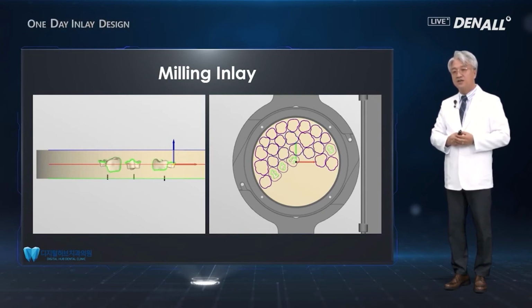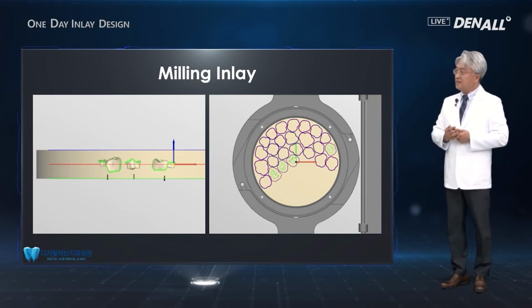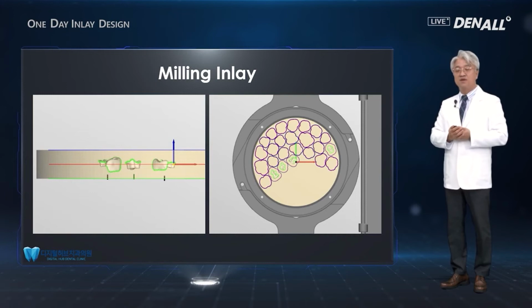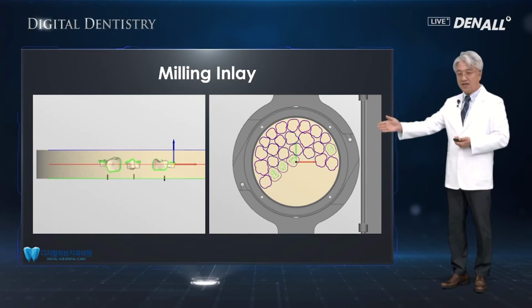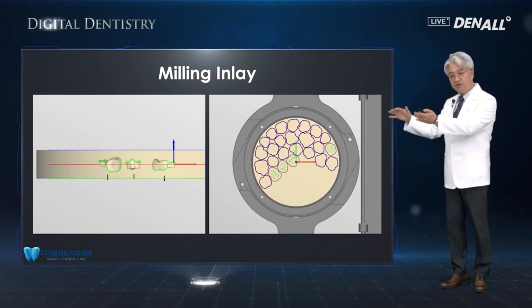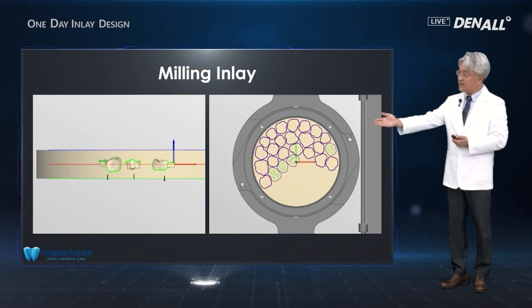In the previous lecture, I talked about the CAD-CAM system and told you that CAD and CAM systems do exist, but the design software is CAD, and using the milling machine doing the production. And with the milling or 3D printing, before you do that step, the software used for operating that is the CAM side. So this is CAM.